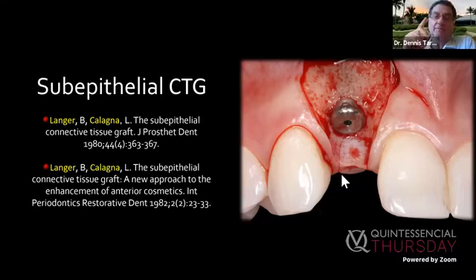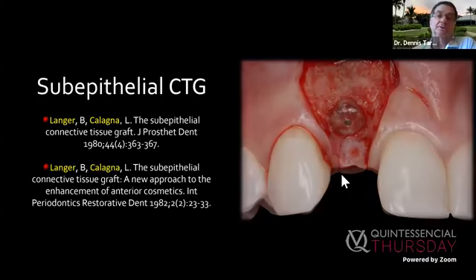If I have the papilla there, I am adamant about this. Not everybody's as good as Uli and Ernst at doing these things. If you have that papilla there, like you have here, the last thing I want to do to fix a mid-buccal problem is to create my own periodontal papilla problem. Recession of papilla is very serious, as you know, and difficult to get back, which we'll talk about in a minute. So I do papilla sparing incisions like this all of the time if the papilla and the attachment on the adjacent teeth are healthy.